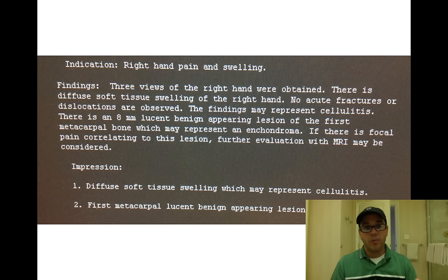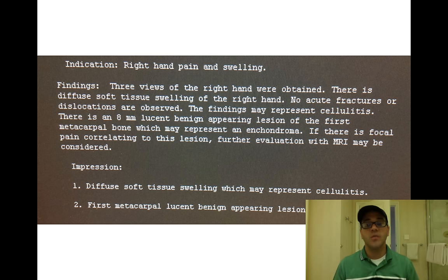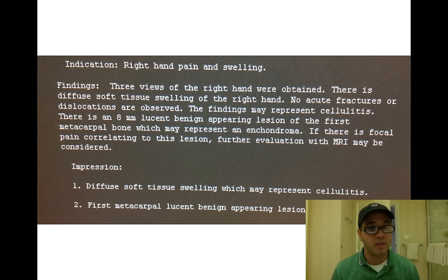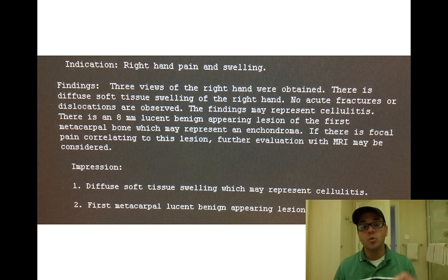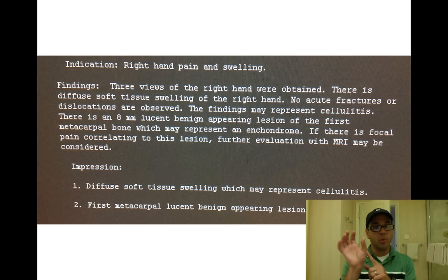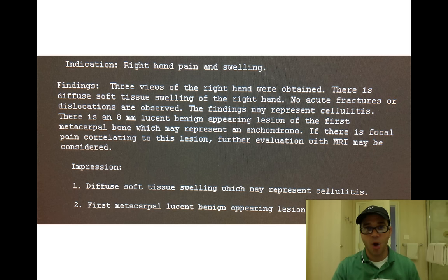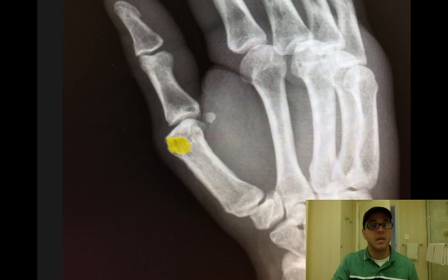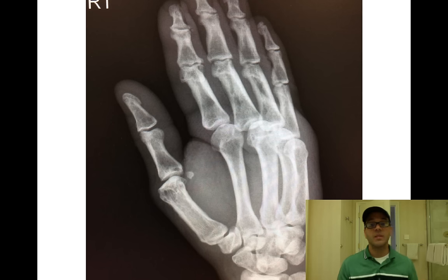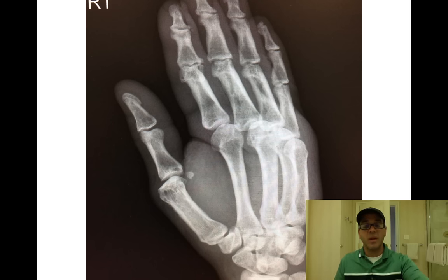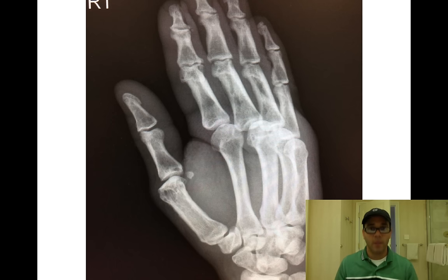Three views of the right hand were obtained. There's soft tissue swelling with no fractures or dislocations — findings may represent cellulitis. However, there is an 8-millimeter lucent benign-appearing lesion in the first metacarpal bone, which may represent an enchondroma. If there's pain on that side, an MRI is recommended to rule out tumors or cancer, though it's most likely benign. Now you can see the yellow spot — that is the missed finding: an enchondroma.